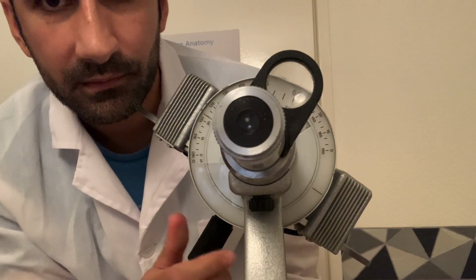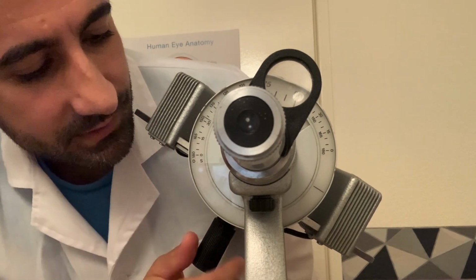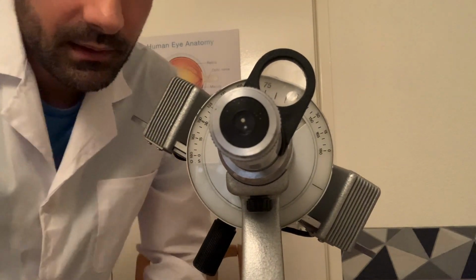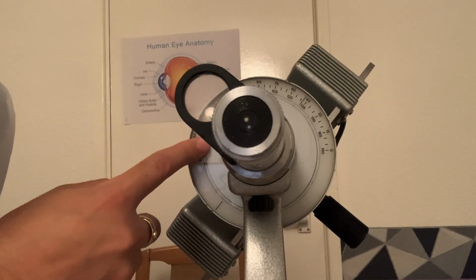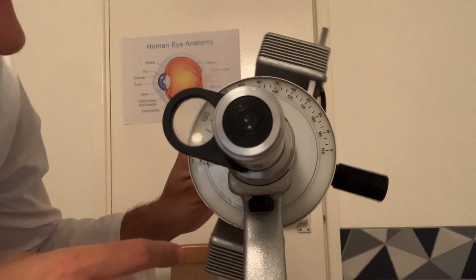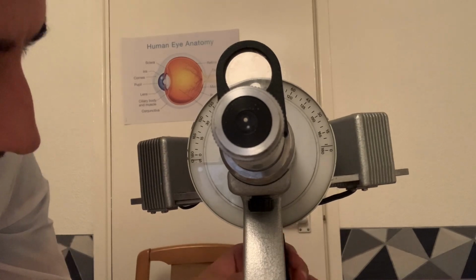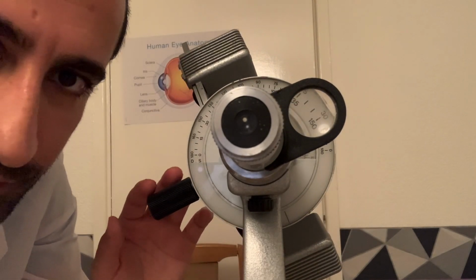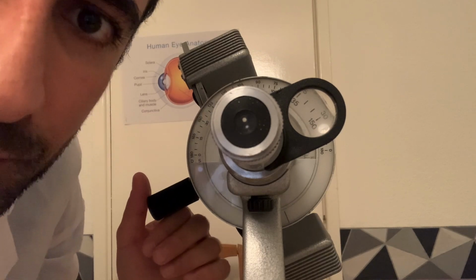And here we have a device which can bring the images closer or further apart when taking the measurements. And when the images are touching, we can read off the small scale just there. It's slightly hidden, but there's a small scale for checking the curvature of the cornea. And this allows us to check the curvature at 90 degrees to one another to determine if there's any corneal astigmatism.